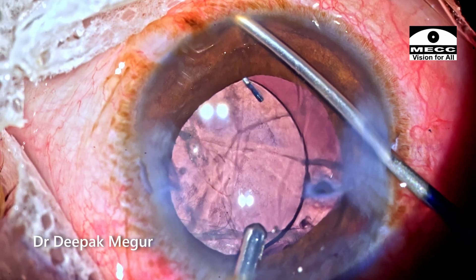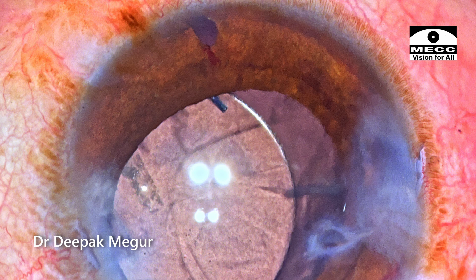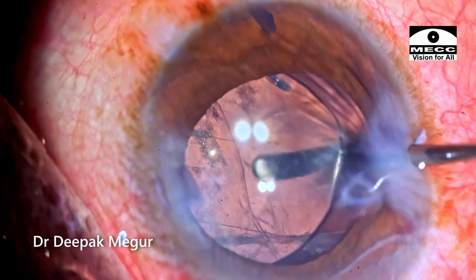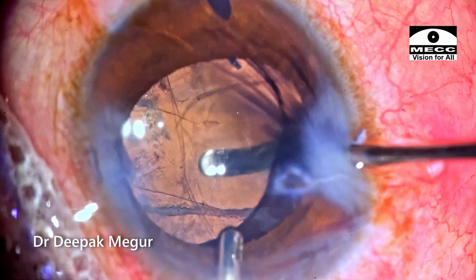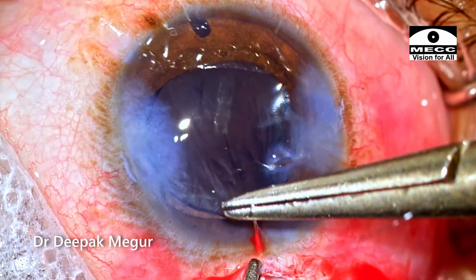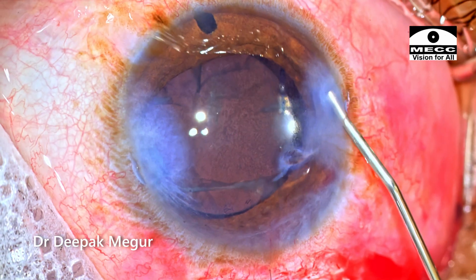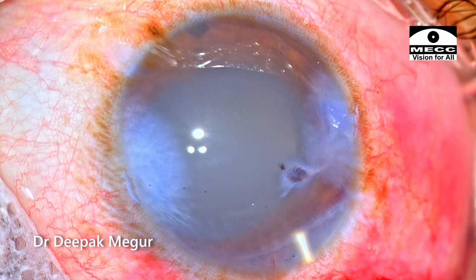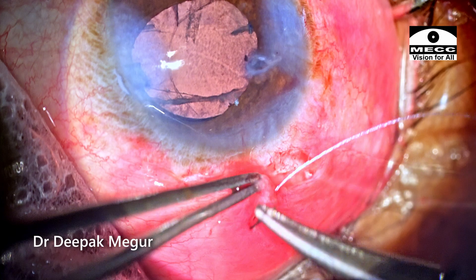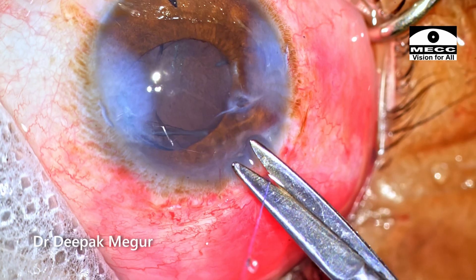The visibility in the superior quadrant was not great so I'm using the inferior quadrant to do an iridectomy using the cutter itself. The iridectomy is slightly larger than preferred but it's functional. The vitrector is used to remove OVD which is behind the lens and some of it may have gone into the vitreous cavity. The side ports are hydrated. The main incision is closed using a 10-0 nylon suture — not strictly necessary since it's a self-sealing sclerocorneal tunnel, but in a vitrectomized eye the eye would be very soft and hypotony could risk infection.